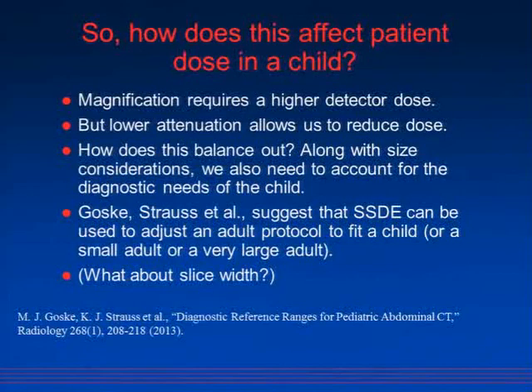Another very important point is that when we look at children, and we had a lovely talk by Kim Applegate, a radiologist, earlier in the week, who pointed out that in children you're often looking at larger things. Even though the child itself is smaller, which would make you think you had to concentrate everything down, you can tolerate a much noisier image in children. The other thing she pointed out is pediatric radiologists generally can tolerate noise more, and it's legitimate for them to tolerate noise more because you're looking at different things.